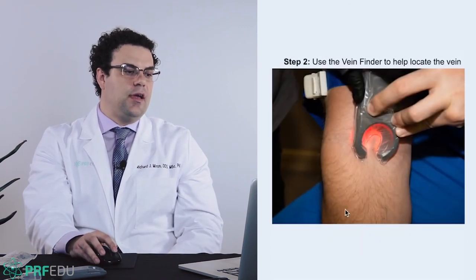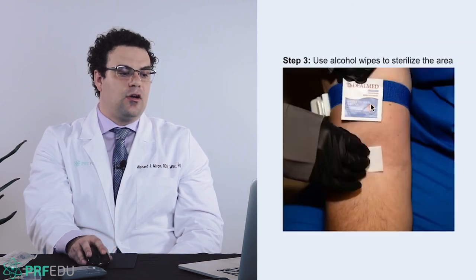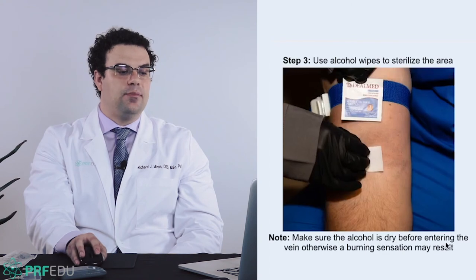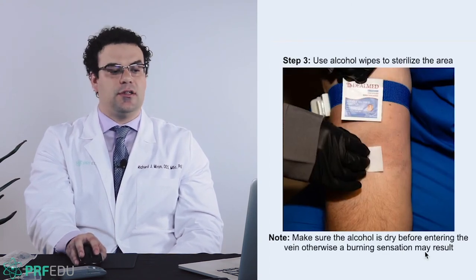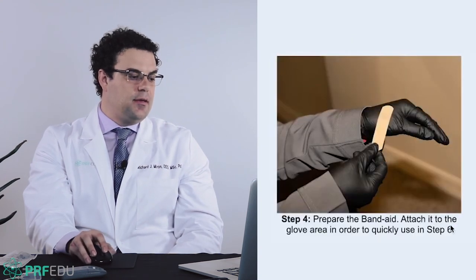Step two, use the vein finder. Okay. Step three, always wipe with alcohol. I've mentioned this already. Make sure the alcohol is dry before entering the vein, otherwise a burning sensation may result. Step four, prepare the Band-Aid, okay? And that you're going to use a little bit later.